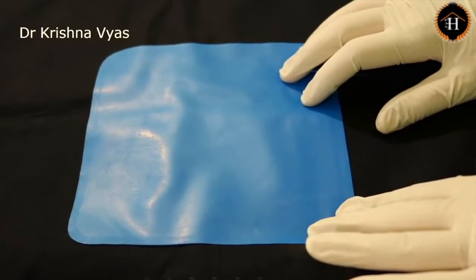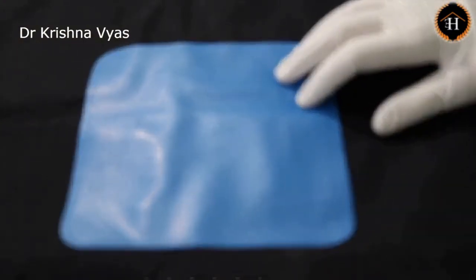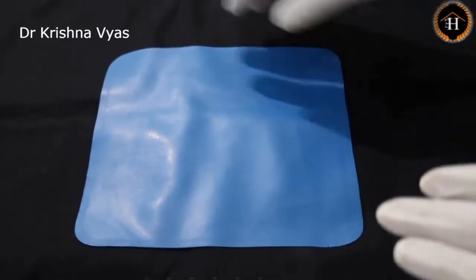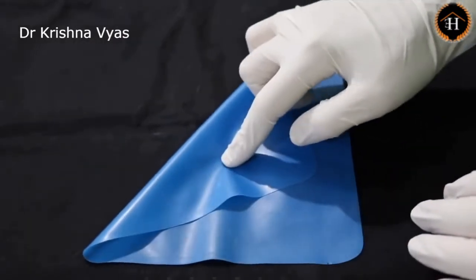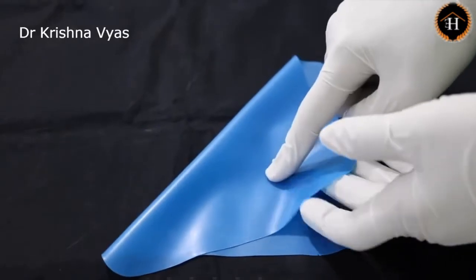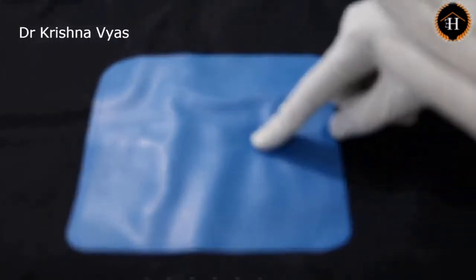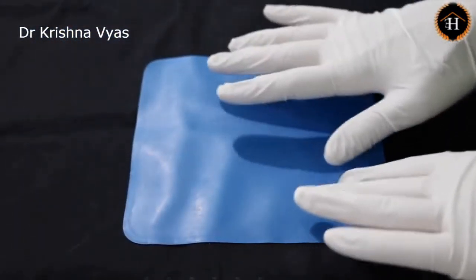The rubber dam sheet is available in different sizes like 4x4, 5x5, and 6x6 inches. The 4x4 is for pediatric patients, and 5x5 and 6x6 can be used for adults. The rubber dam sheet has two surfaces: one is a shiny surface and the other is a dull surface. The shiny surface should always be facing the tissues, whereas the dull surface faces the outer side. The sheet is also available in various thicknesses.